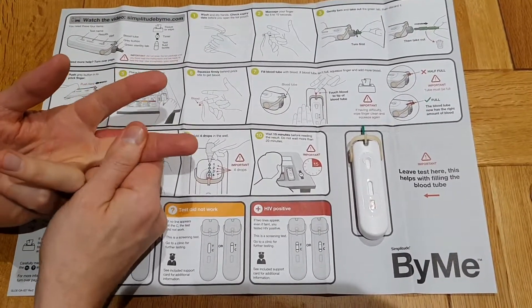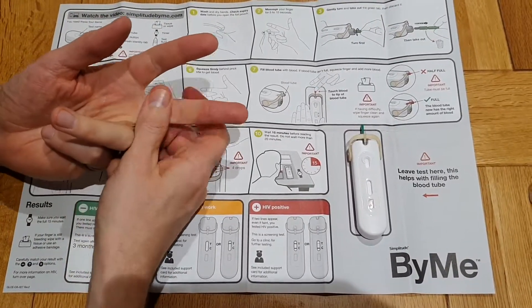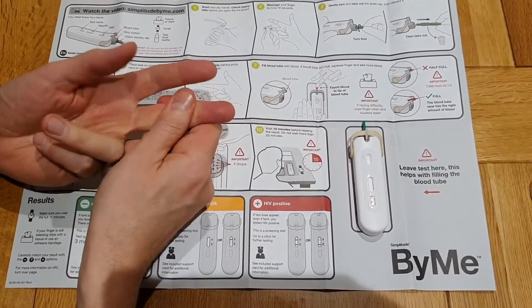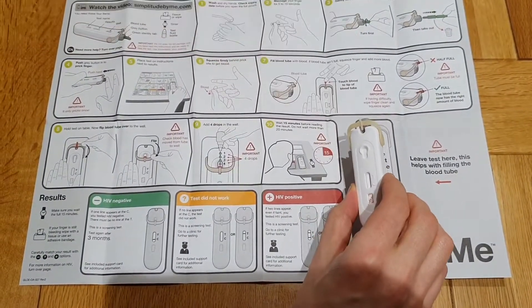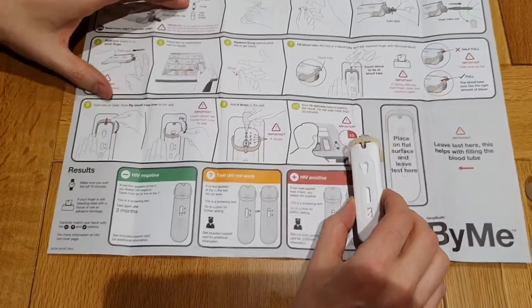Another way of doing this is just run up and down the stairs to get the blood pumping. Okay, and it gives you an idea of how easy these tests are going to be. And done that bit.